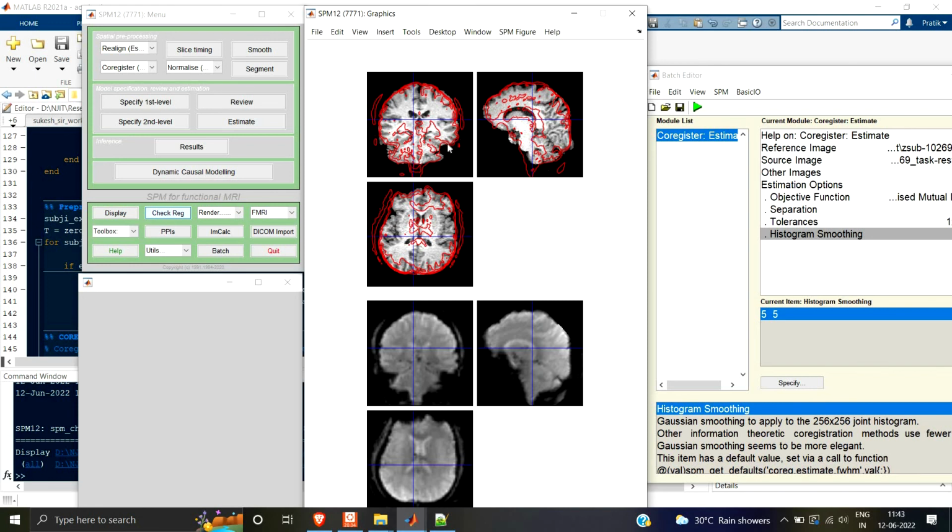Okay, so the only advantage of skull stripping is that you get this skull removed, so you just have the brain portion now, which can be more easily aligned with the functional image. Okay, so this is how you can do it with AFNI. The same goes with FSL.